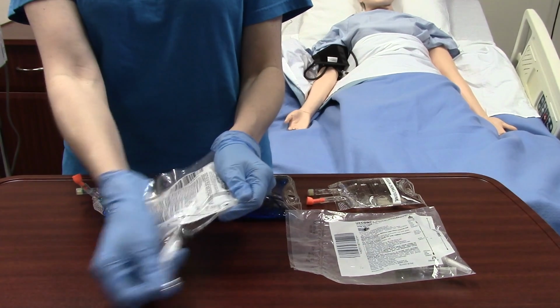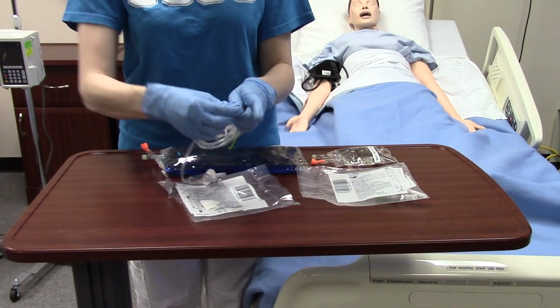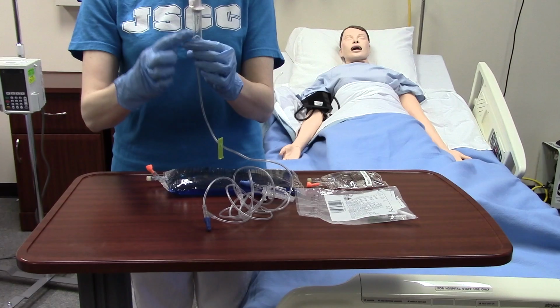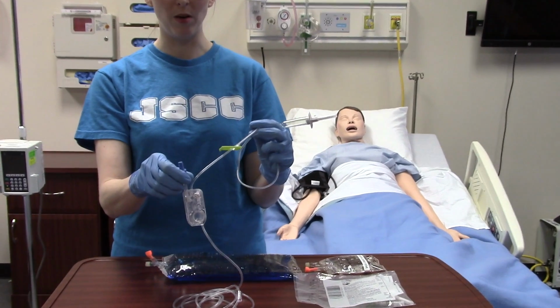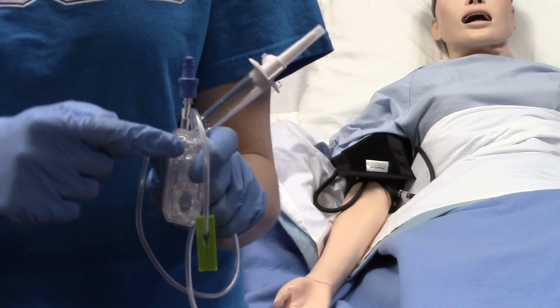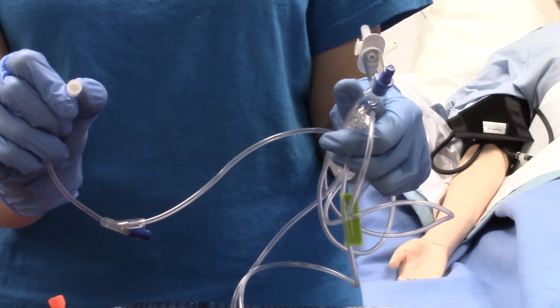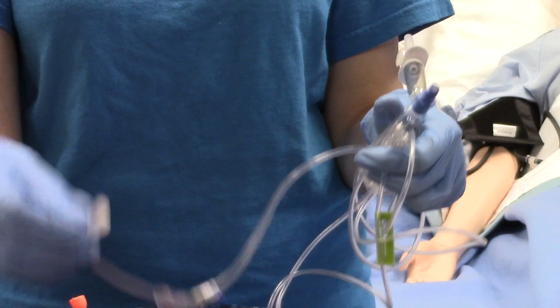This is perforated, so we'll tear it open. This is the spike coming down. This is your drip chamber. This is the cassette that will be loaded into the Plum pump. This is a clamp as well that you can open and close. We will prime all of this tubing before we put it in the pump. It does have an air release cap on the end that will allow air to come out but not fluid, but it will keep the tip sterile so you can set it down.